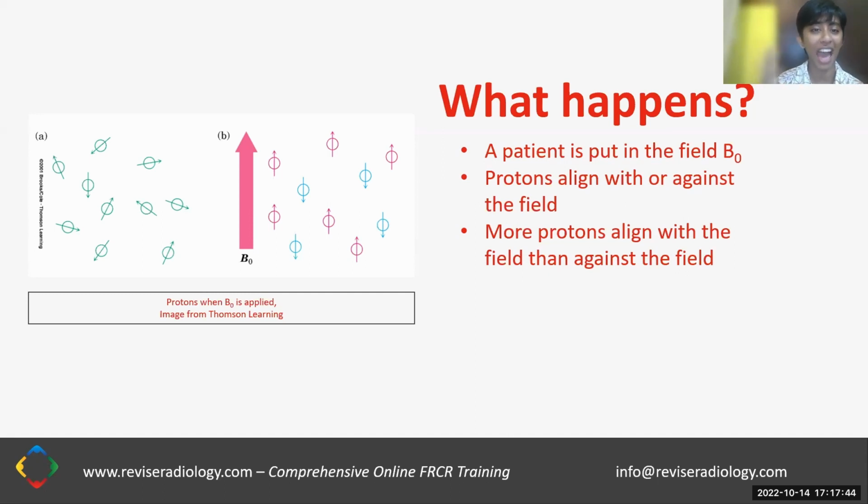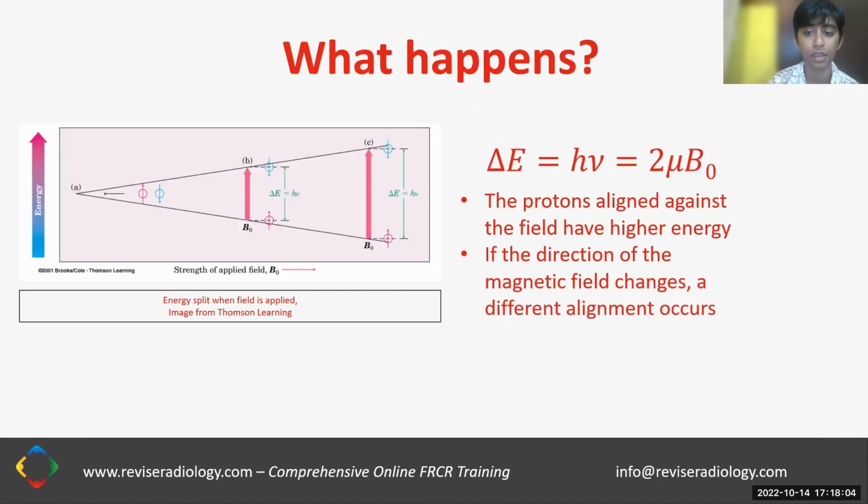That's kind of a hand-wavy explanation, but we'll talk about what it means for magnets to align in 2 different directions in just a second. But the answer is that it's a quantum magnet and there are quantum effects at play, which cause the alignment of the field to be one or the other.